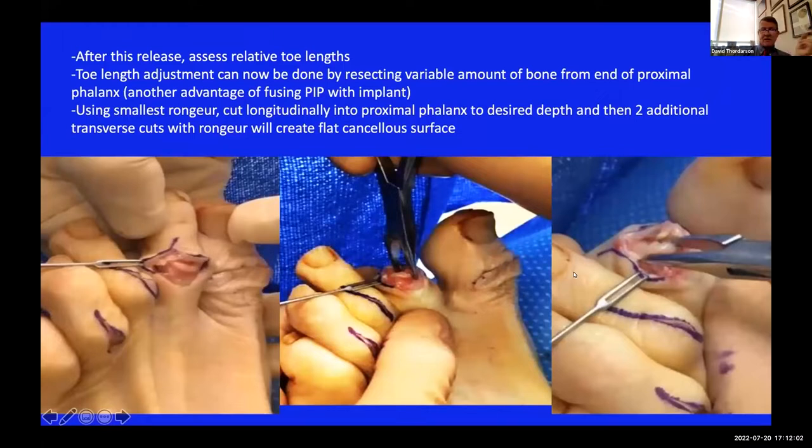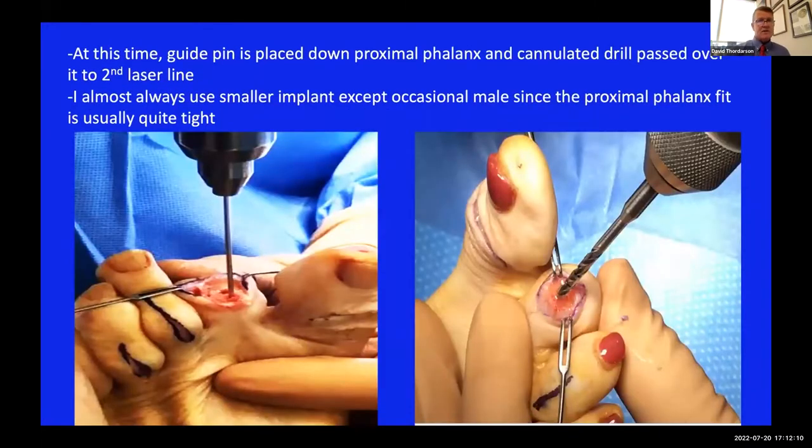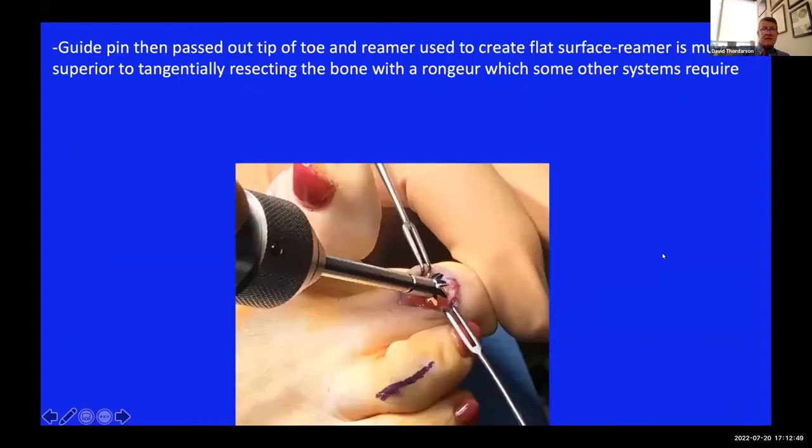Since the proximal phalanx is sticking out facing you, getting a flat cancellous surface is easy. The mid phalanx is not as easy, which is why this system has a nice reamer. Once you have the flat cancellous surface, drop your guide pin down and drill to the second laser line. I almost invariably use the smaller implant - even the second toe often has a pretty tight intramedullary fit. If you can pass that drill down to the second laser line, you should be able to get the implant in. You'll never have a problem getting the implant into the mid phalanx - it's cancellous bone - but you will have an intramedullary fit in the proximal phalanx.